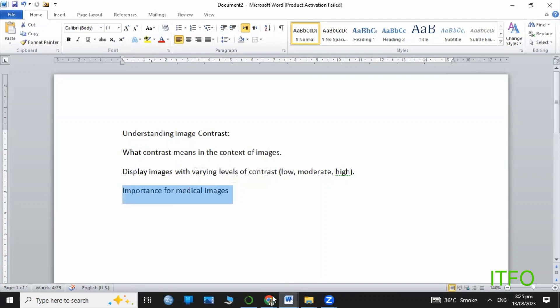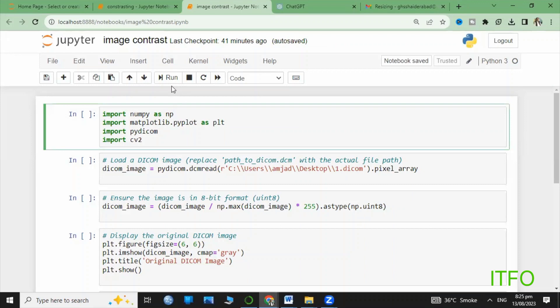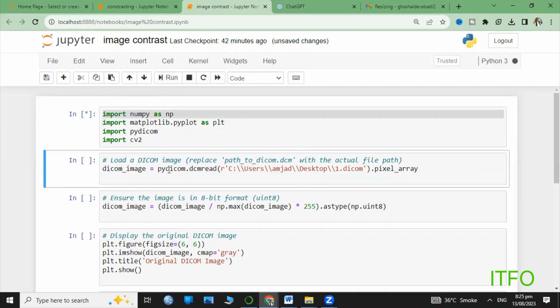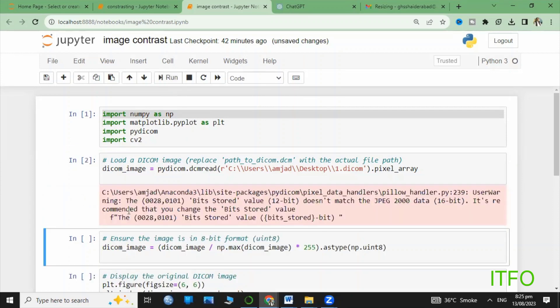On the screen, you can see we're importing the required libraries. We discussed these libraries in previous lectures. Next step, we are loading and displaying the original image.